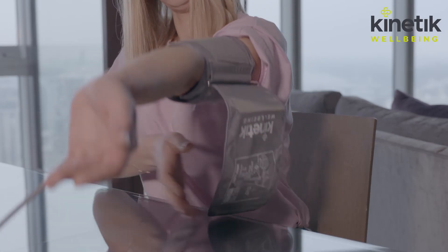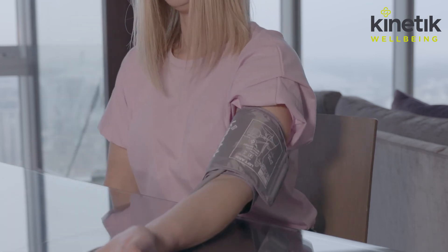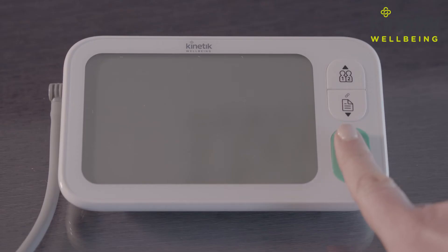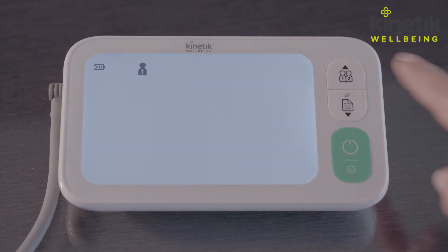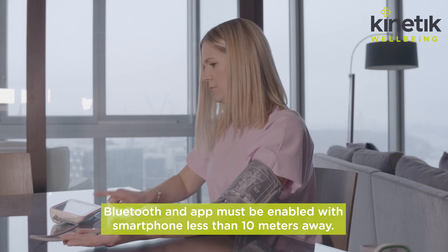Use your left arm, making sure to remove any thick clothing and rest your arm on a hard surface. Step four: take a measurement. Select user and press Start. Don't talk and relax as the cuff inflates. Once the measurement is complete, results will be automatically transmitted to your smartphone.